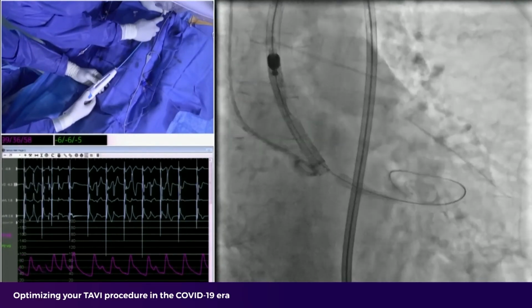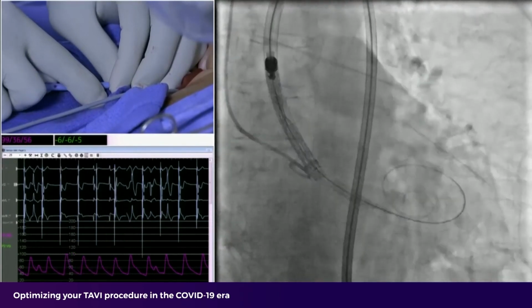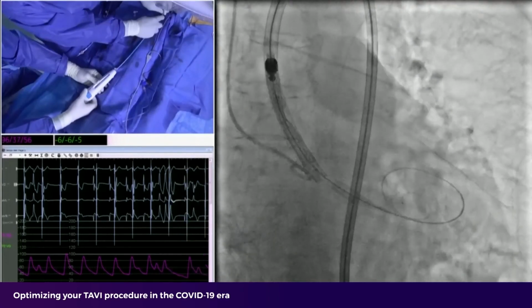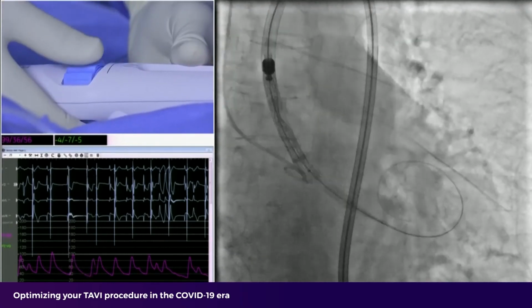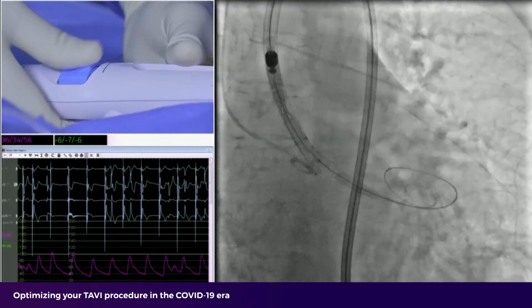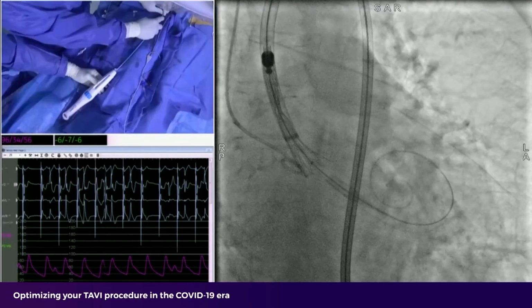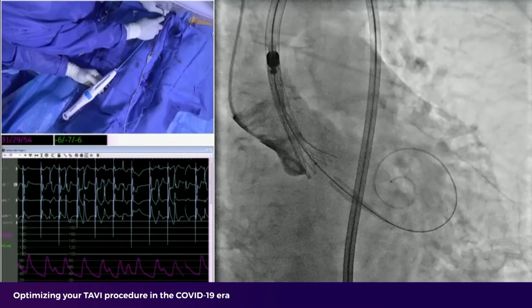Okay. Yeah. So let's try to keep it here. Okay. So far it remains high. So the speed is good for release. I like it. I like it very much. From time to time, I keep an eye on the ECG. Yeah. Okay, let's make a pause here. It's going to expand, and we're going to inject. Okay.